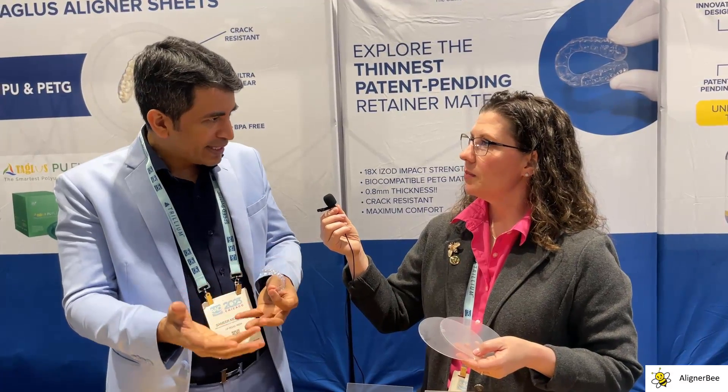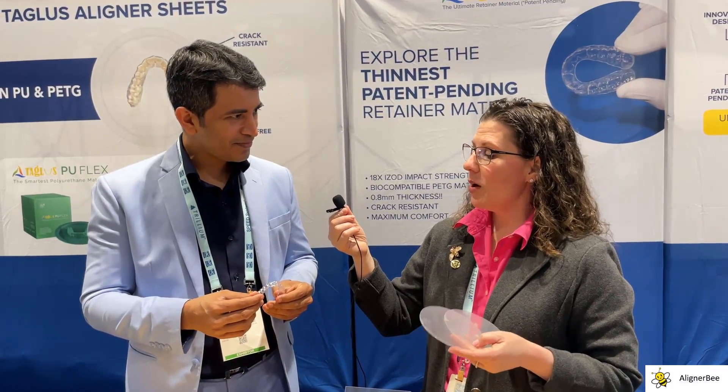When we're working in the clear aligner space, one of the factors that many of us are concerned with is stain resistance. How would you look at the different types of materials? PU-Flex has very good stain resistance. Polyurethane in general is bound to become slightly yellow with time. So we have added special antioxidants and special optical brighteners for it to last longer and have more stain resistance compared to other materials. Would you anticipate the patient noticing any discoloration in seven days? Not at all. Absolutely nothing. Even for a retainer, you could wear this for six months and you would hardly notice any discoloration.